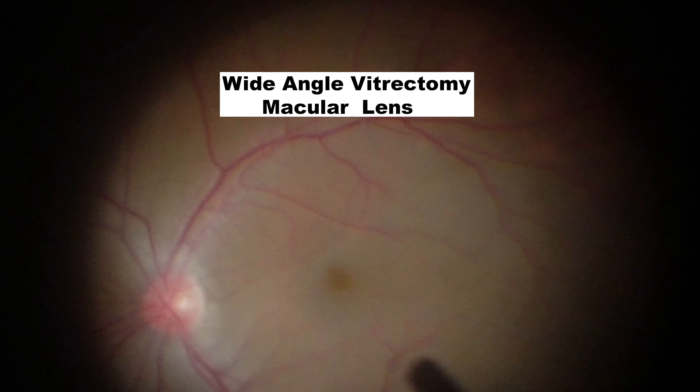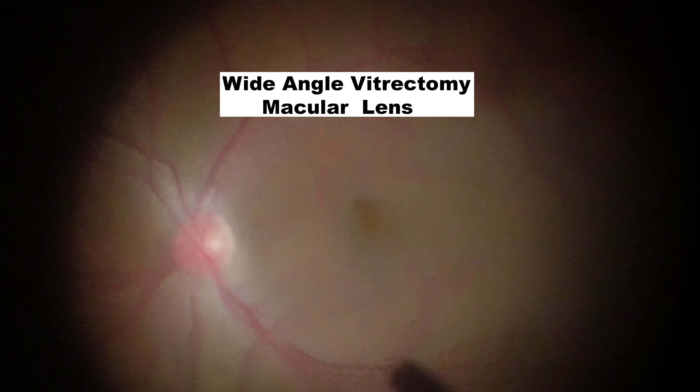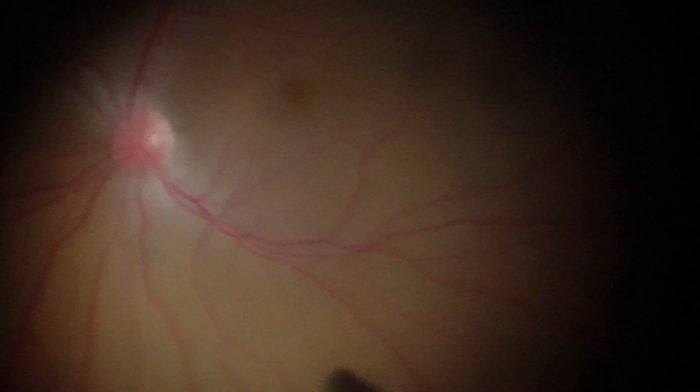It is time now for a T-shaped retinotomy, very focused so as to help in the drainage process and remove additional sub-retinal fluid. I like to observe the macula after these steps to make sure it is uninvolved.